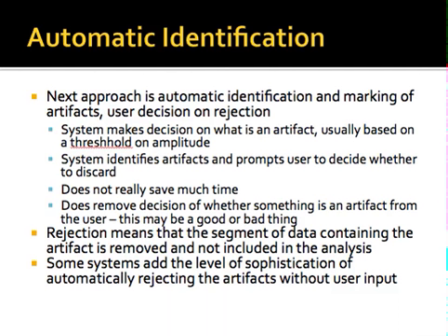The other issue is if you just randomly pull out a segment of data, you're attaching two segments of data that are not adjacent. And so you can have these step function type shifts between points, which creates problems with your frequency analysis. So removal or rejection of artifacts through just removal of the segment that has the artifact in it carries some issues.